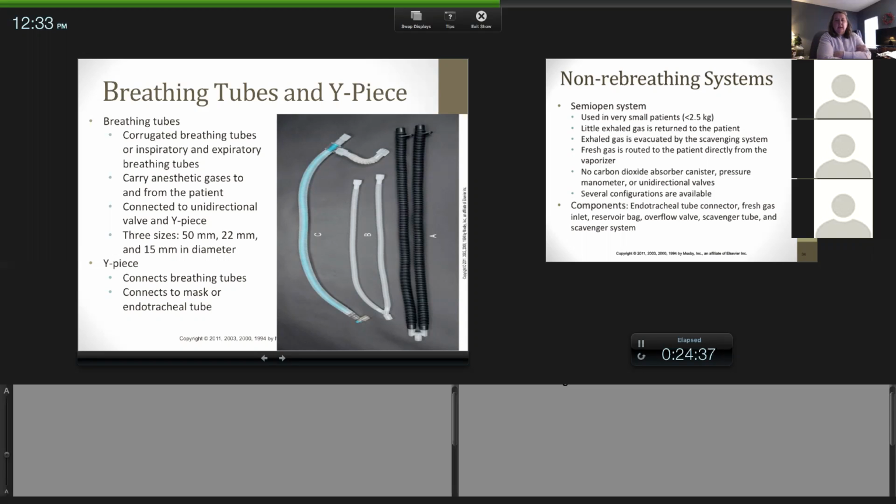So the problem is whenever there's a tube in a tube. I'm kind of used to these rebreathing systems here, which are the black corrugated tubes. I'm not a huge fan, but I've seen these clear. And then the one in the middle is the pediatric rebreathing. I think you use 15 to 25. I used to use 15 to 30 for the pediatric rebreathing, and then 30 pounds and up for the adult rebreathing.